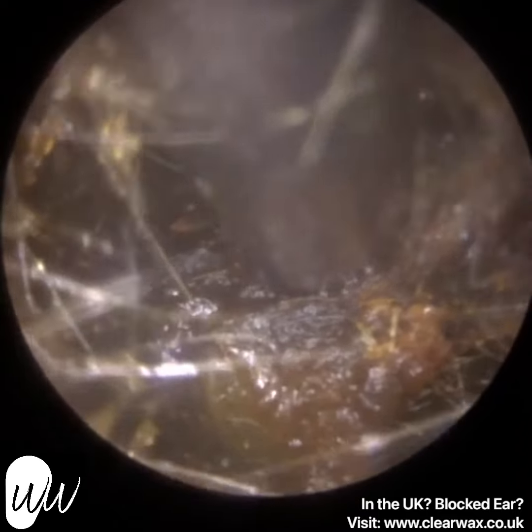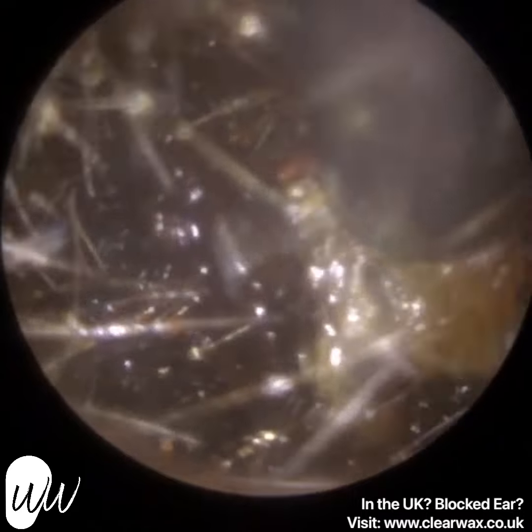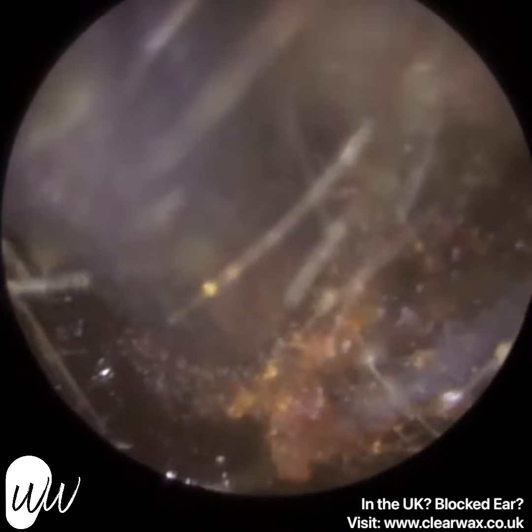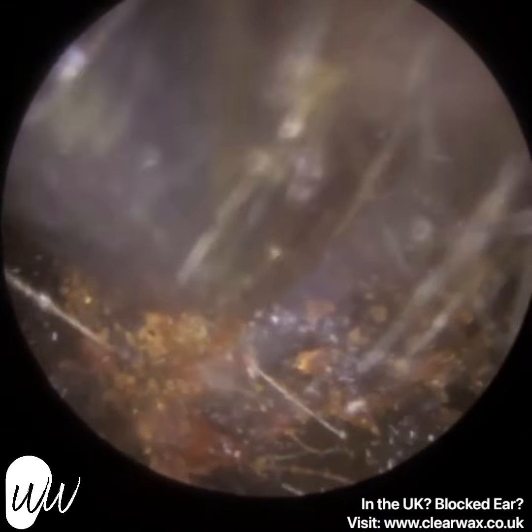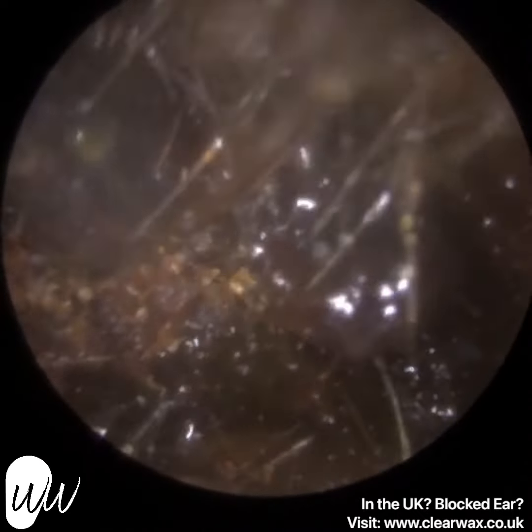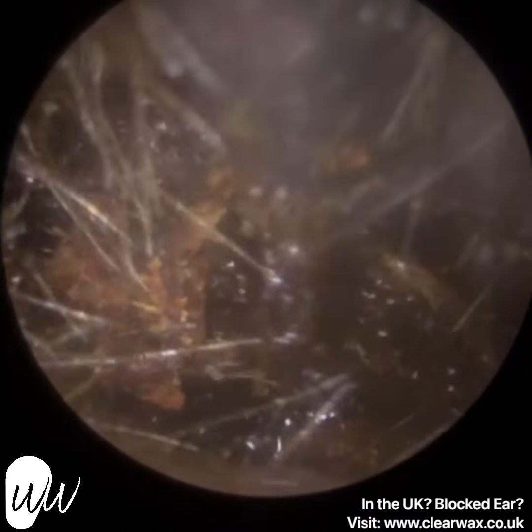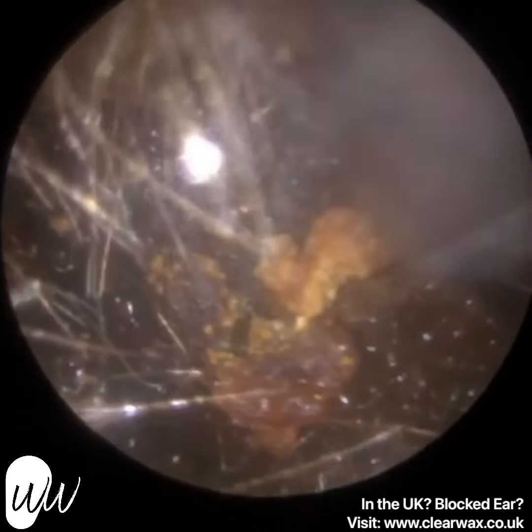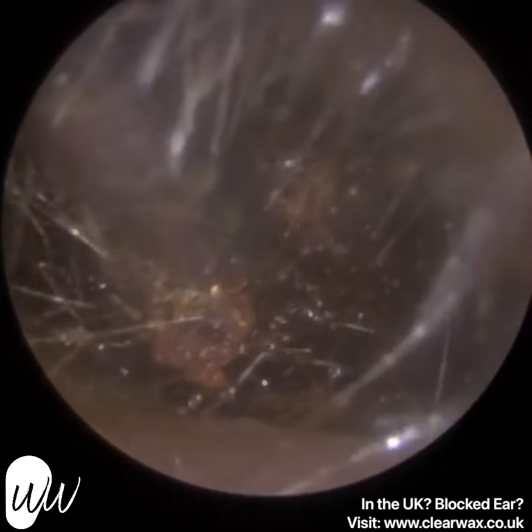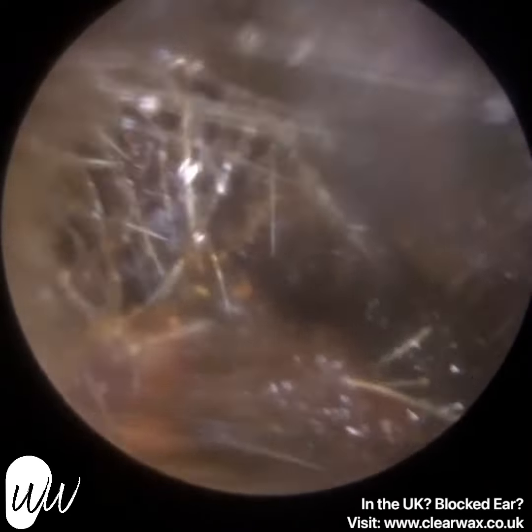So slowly but surely bringing this forward, and it's fully lodged. It was a severe blockage, as I mentioned at the beginning of the video. In fact, the patient wasn't able to hear my suction machine, which was right behind them to their right ear, and it's pretty loud. The noise of the suction machine itself is not the noise the patient hears inside the ear. It's not as noisy as that inside the ear, although microsuction can be noisy in its own right.